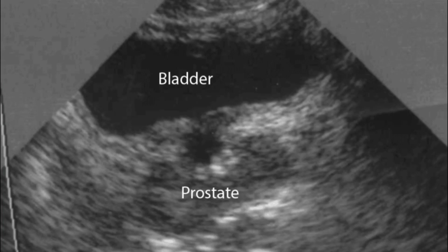You can appreciate that the normal prostate size is 30 grams. It should be less than 30 grams, and if it is more than 30 it will be considered an enlarged prostate. How will you take the prostate measurement? There is a criteria, a proper procedure. You have to follow that criteria, and also the ellipsoid formula to take the volumes.